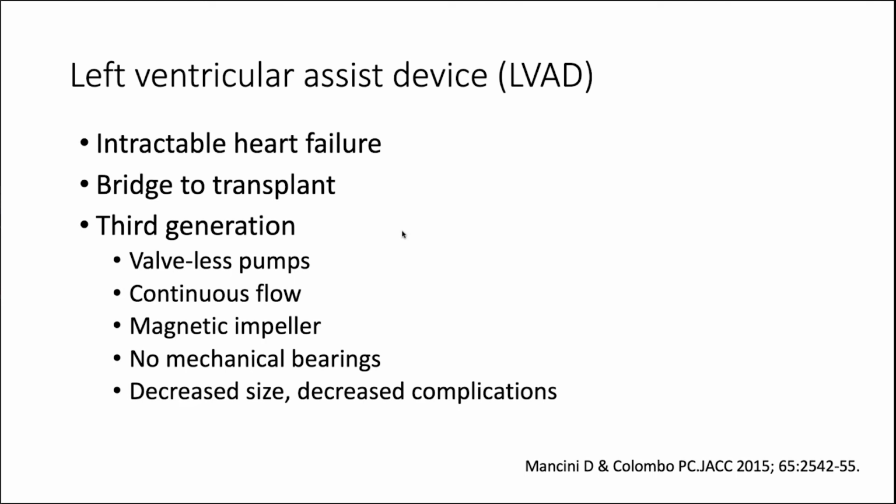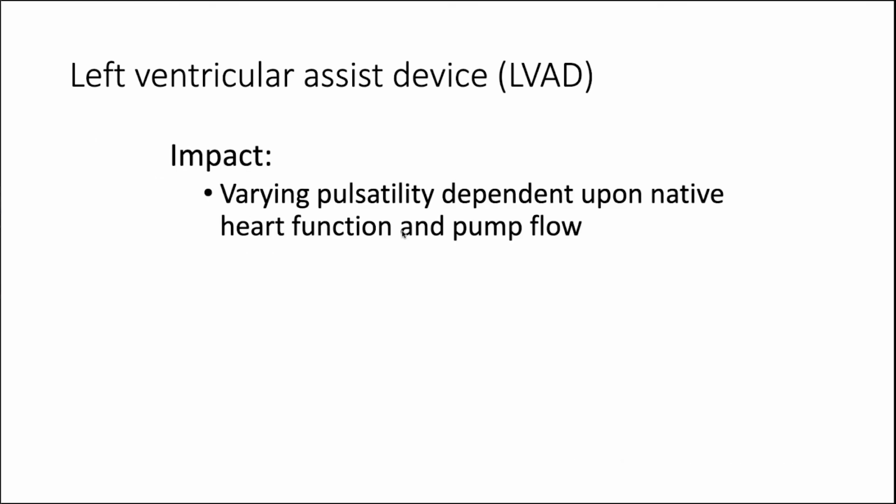The impact of a left ventricular assist device on peripheral flow really depends on the nature of the device itself. Is it a pulsatile flow or more commonly continuous flow? And what about the natural heart function? What you see in the peripheral flow patterns is a combination of the pumping, continuous or pulsatile, of the LVAD, plus whatever it is the heart may be doing to contribute as well.